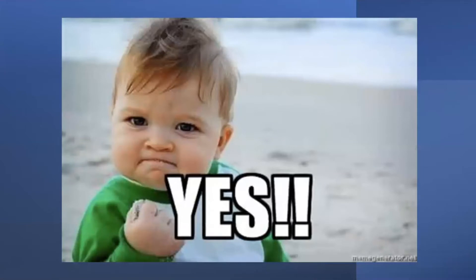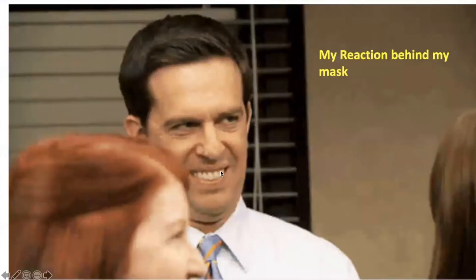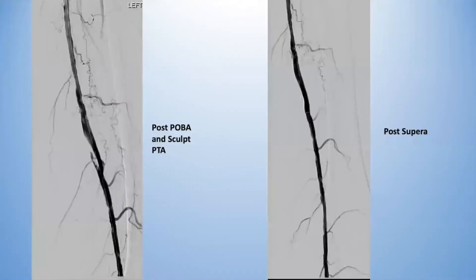The next step is you're de-escalating wires, and this is what happens — you went subintimal. You eventually get across, whether it's re-entry or the wire goes through, but after ballooning this is what you're left with. That's not a comfortable situation. Even if flow goes down, there's no reason you should ever leave a dissection like this, again in that same area of heavy disease just past Hunter's canal.